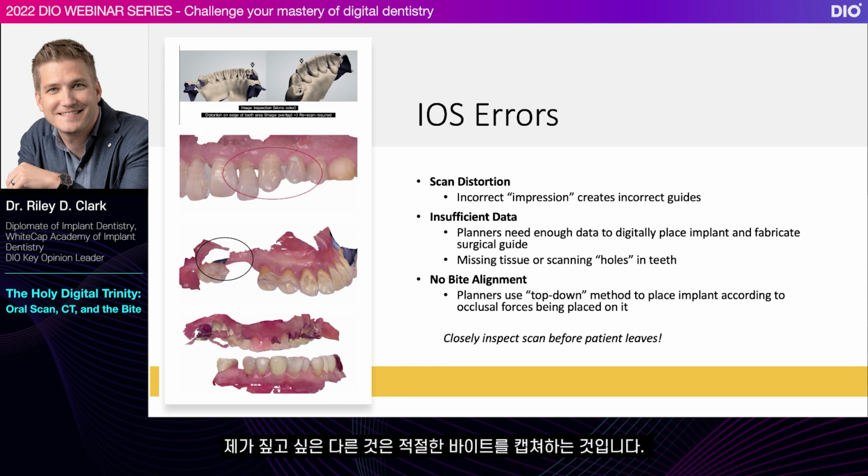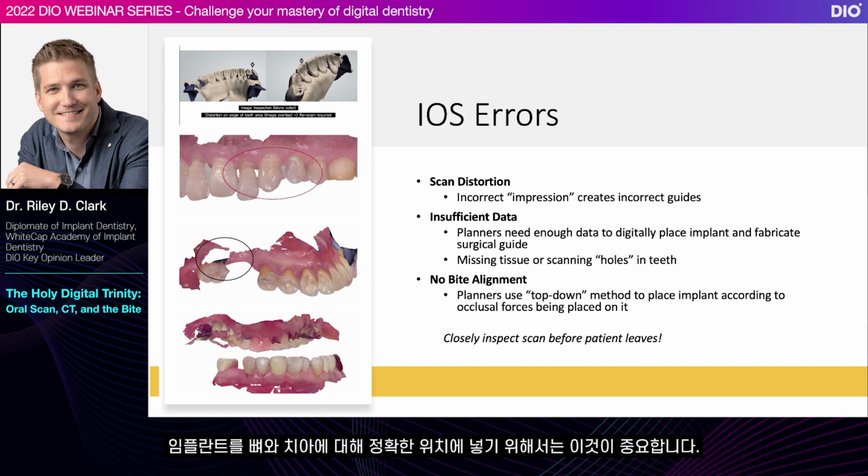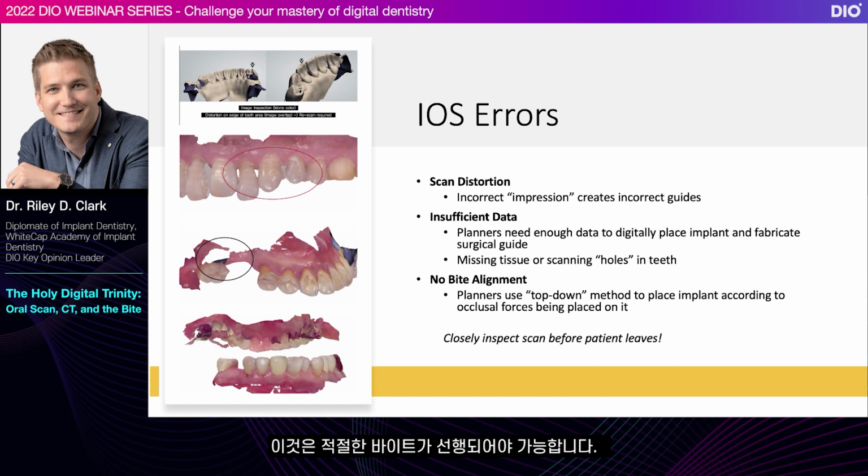The other thing I want to mention is capturing a proper bite. As you know, with our full arch workflows, we're not just planning implants, but we're also planning prosthetics. So getting the implants in the right position relative to bone and teeth is important, but also important is that the teeth fit over the implants in the proper occlusion. And that's accomplished by getting the proper bite.